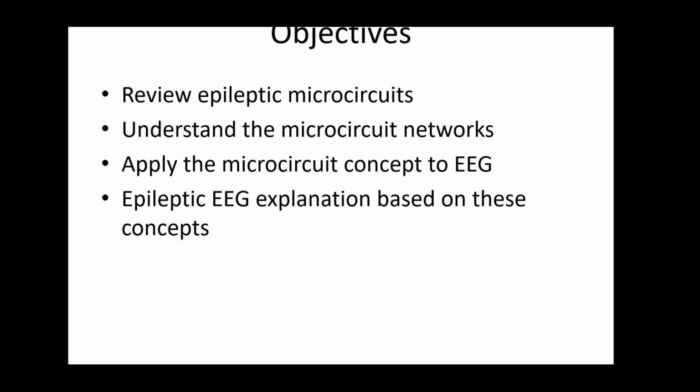So the main objectives of this talk are to review the epileptic microcircuits, how these networks apply to EEG, and how this leads to an explanation of the epileptic EEG.